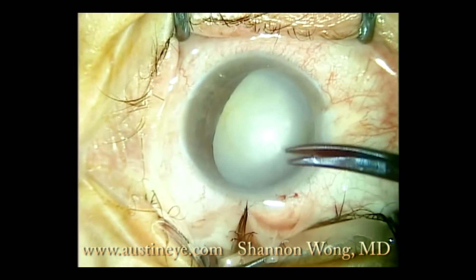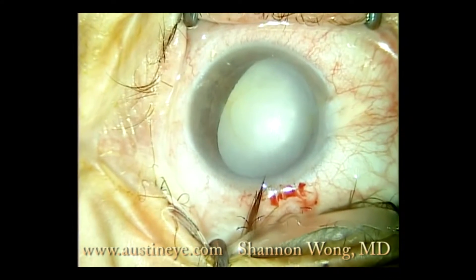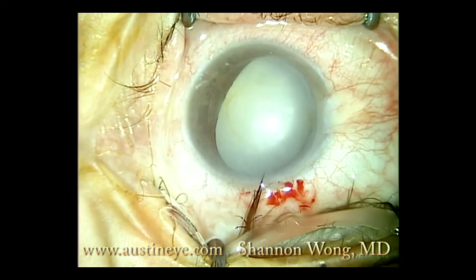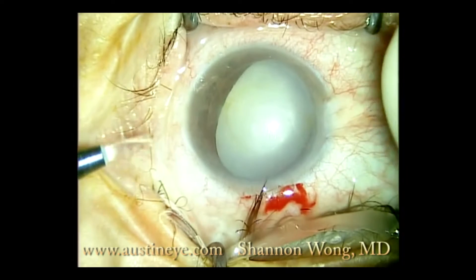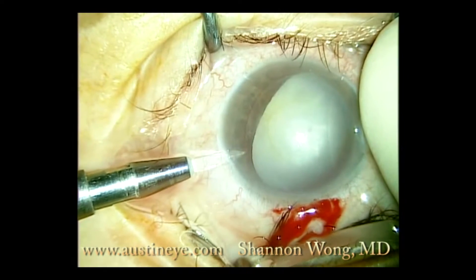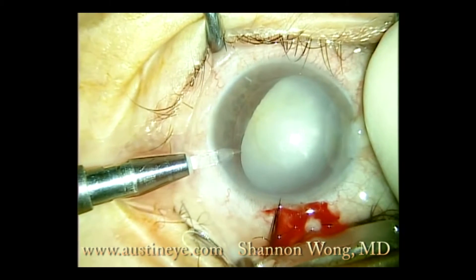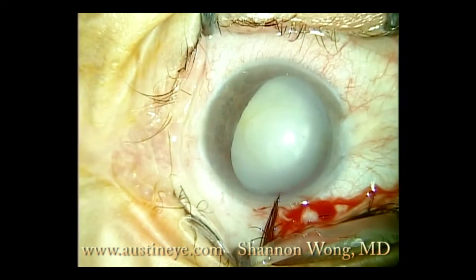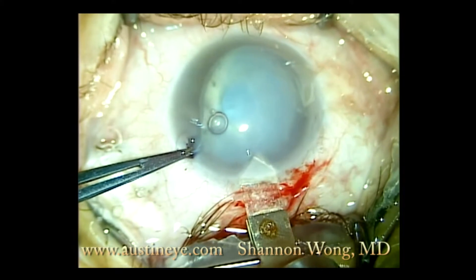Hi, this is Dr. Shannon Wong. I'm going to narrate this case, which was a very challenging cataract surgery operation. The patient presented after undergoing hyperopic LASIK some 12 years ago with a white cataract. This is his only functional eye. The anterior chamber is very shallow and the cataract is white.